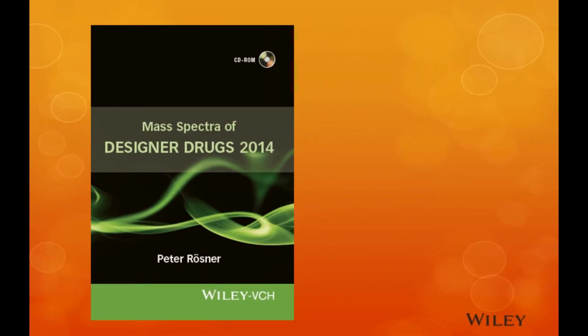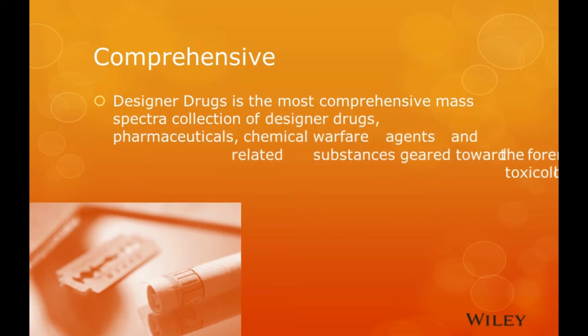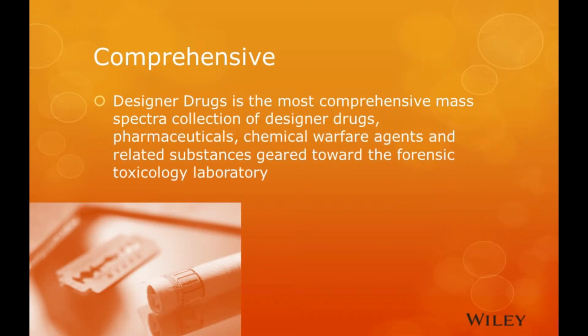Welcome to Wiley VCH's demonstration of the Mass Spectra of Designer Drugs 2014. Designer drugs are a problem all over the world, and Wiley VCH has partnered with Digilab to provide the most comprehensive and up-to-date collection of mass spectral signatures in the field.